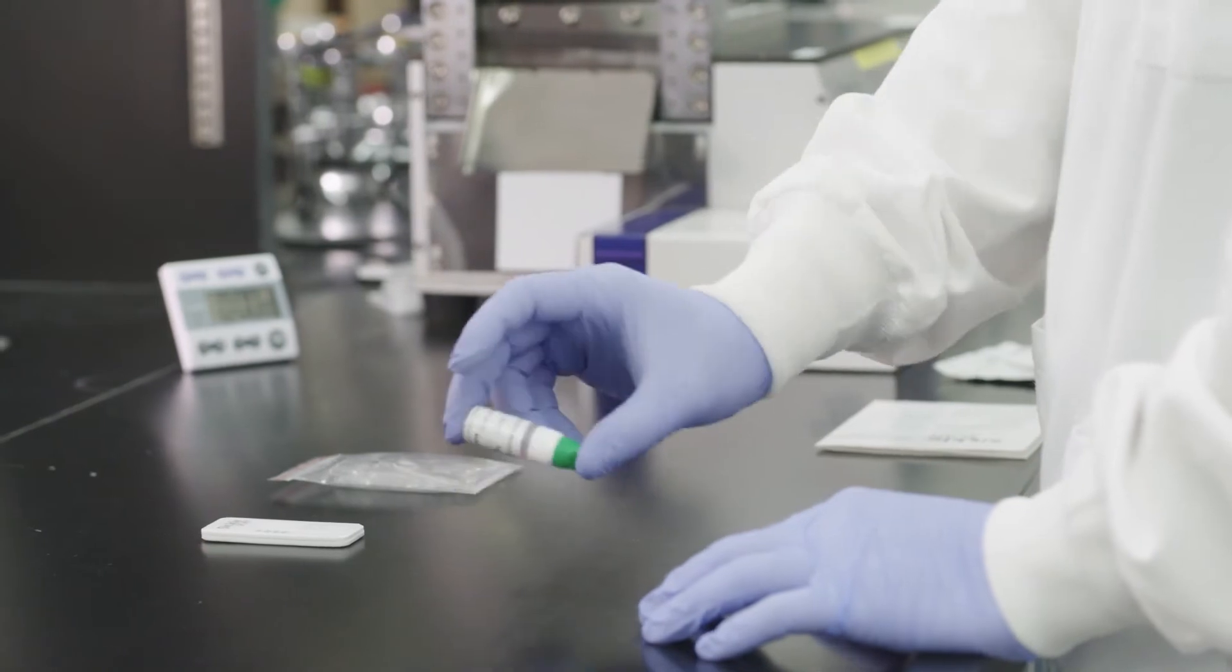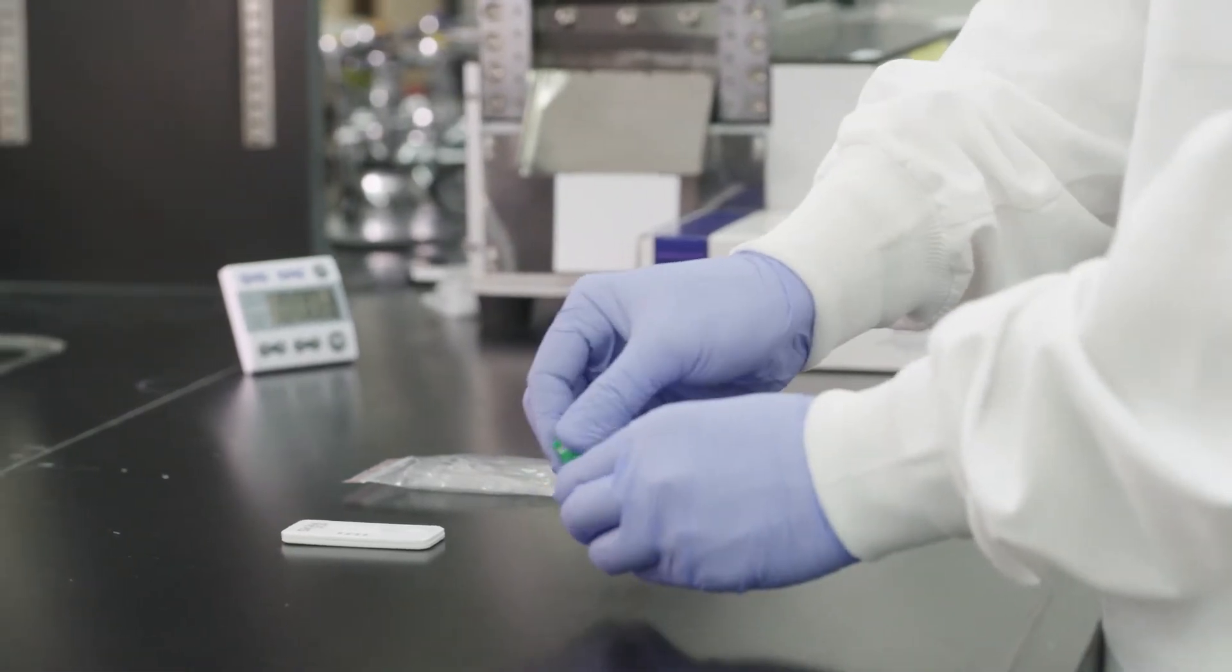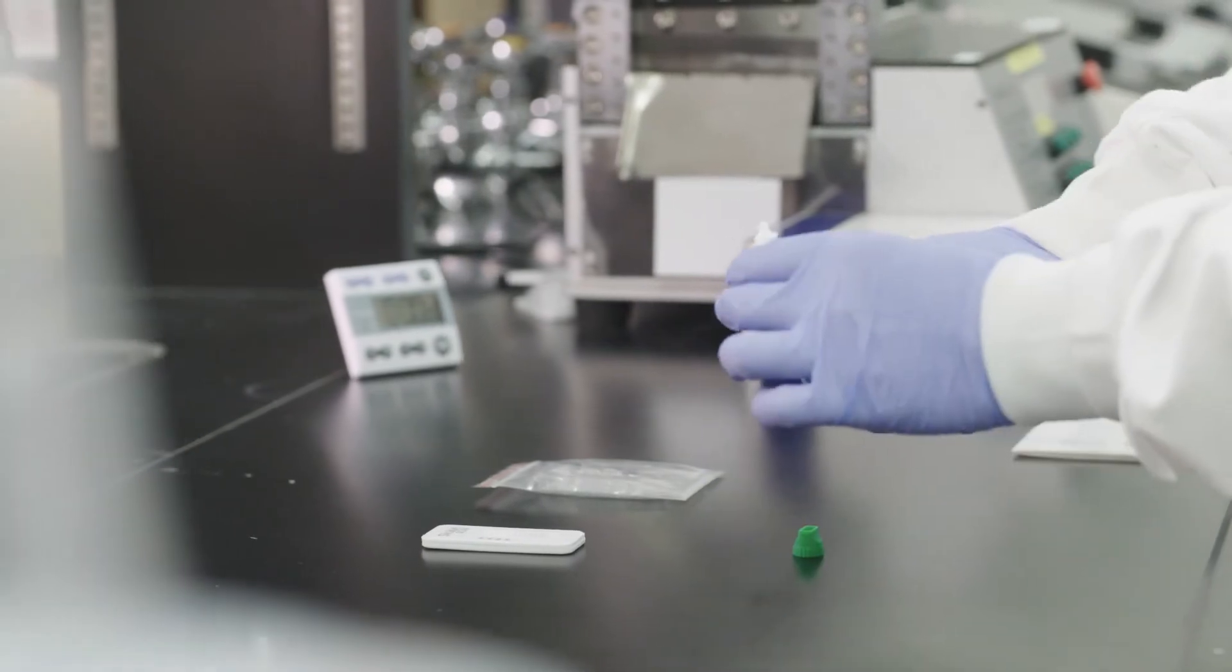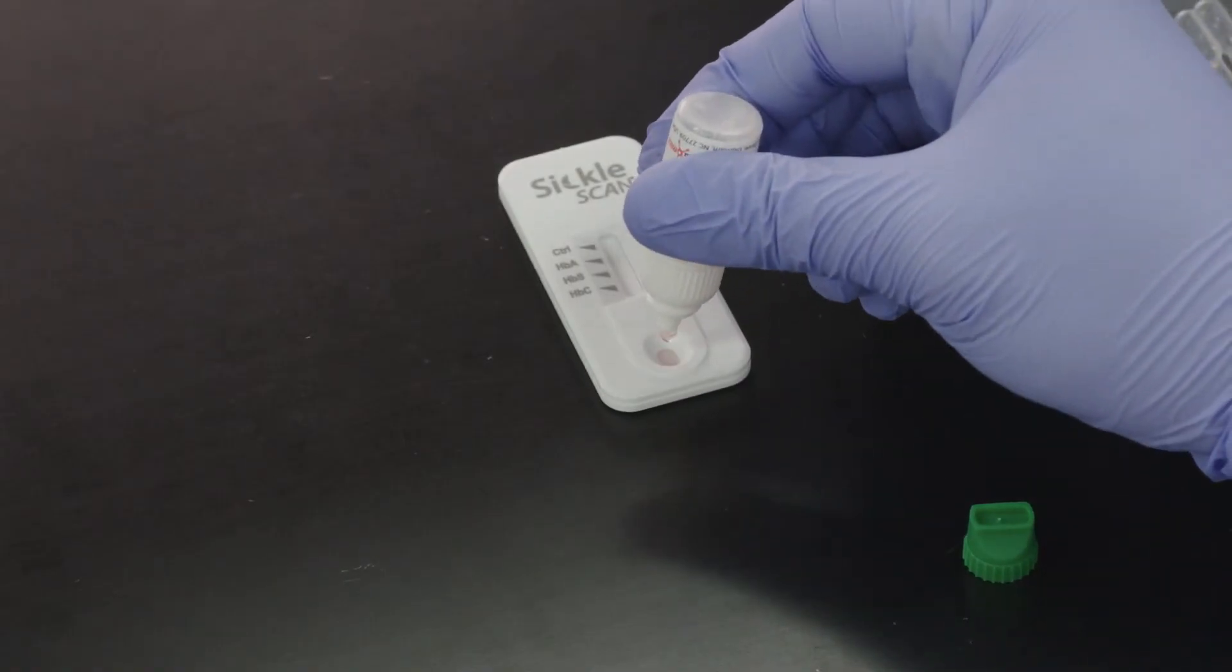Invert the module three times to thoroughly mix the test. Next, remove the green part of the two-piece cap and dispense five drops of the solution directly onto the SickleScan device.